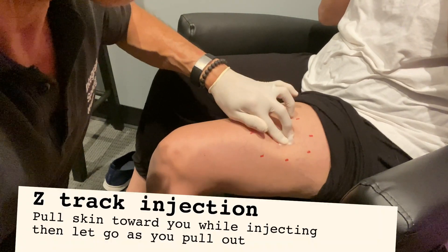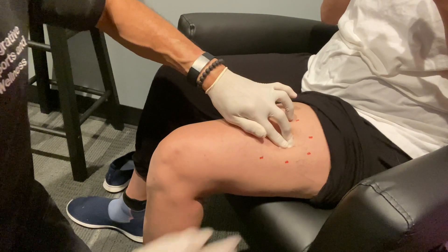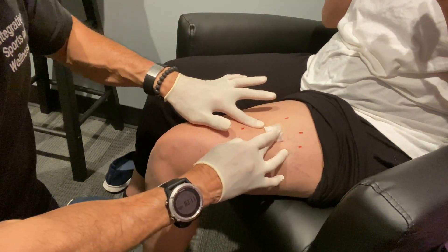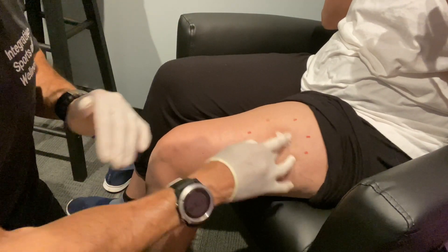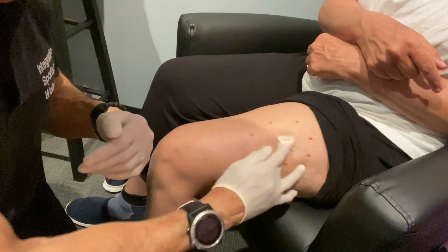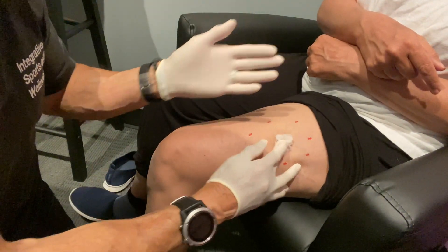I didn't do the Z-tracking again, but in a lot of cases when you're putting the needle in, if you pull the skin this way, then put the needle in, and as you take the needle out you let go, it allows the skin to tamponade off. That's Z-tracking. Mrs. D said that this was more painful than the arm — duly noted. It is an option because it's an easier access for Mrs. D compared to reaching over and doing your own shoulder.